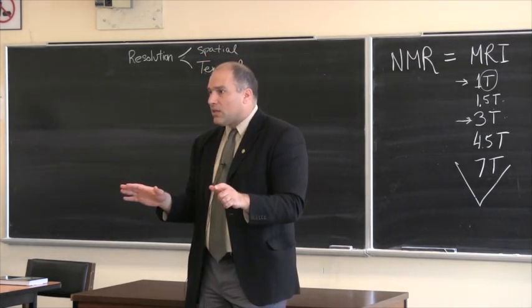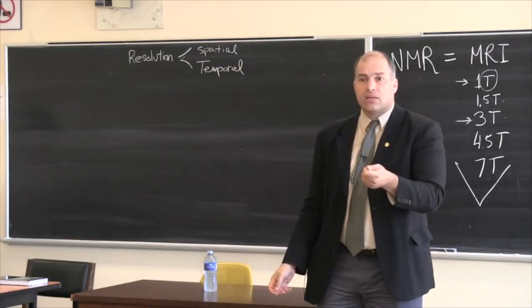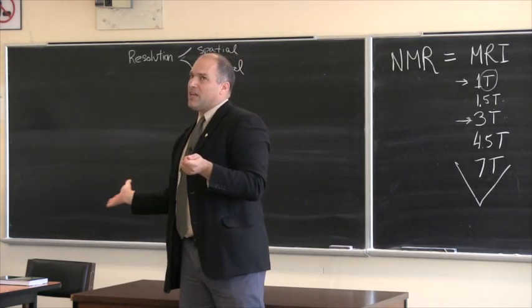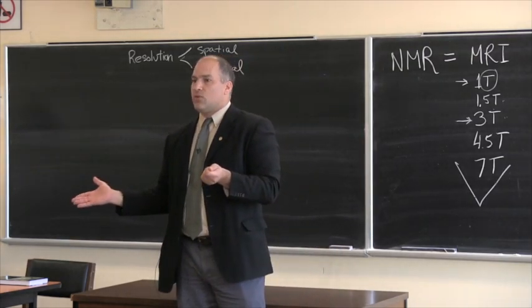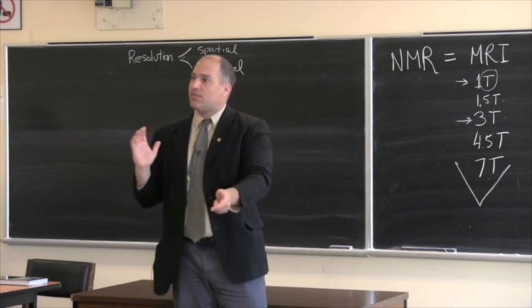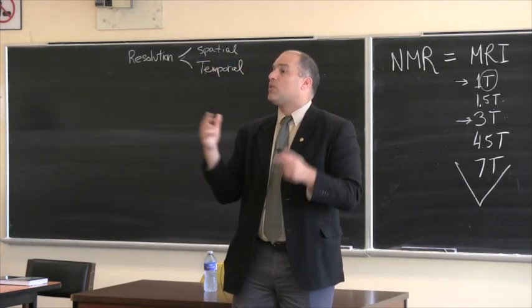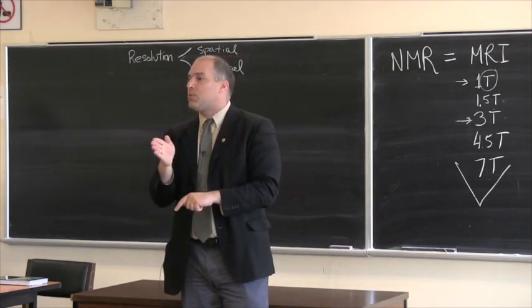You can't see it regularly, but if you put the blood in a very strong magnetic field and you perturb it, how do you perturb it? It's very technological, but you basically give the magnetic field a very strong jolt. The jolt is called a radio frequency wave. You give it a very strong magnetic wave, and you see how long it takes for certain elements in the blood, according to some theory of statistical mechanics, to line up with the magnetic field.